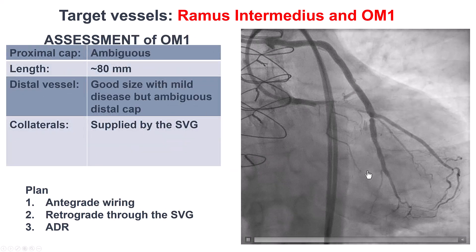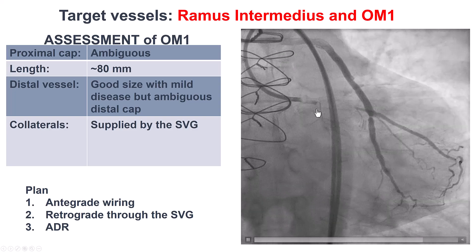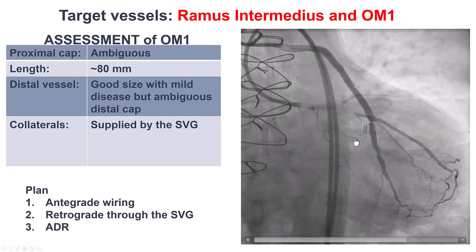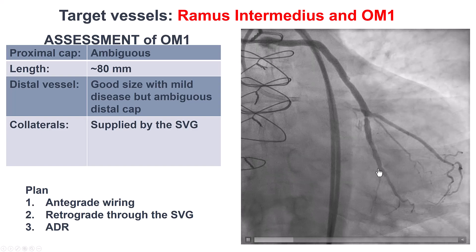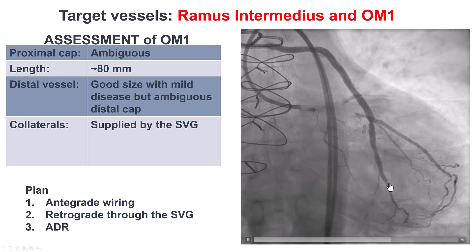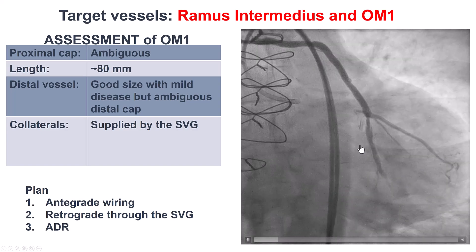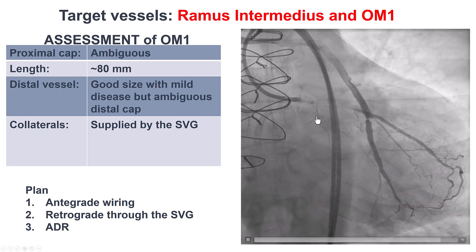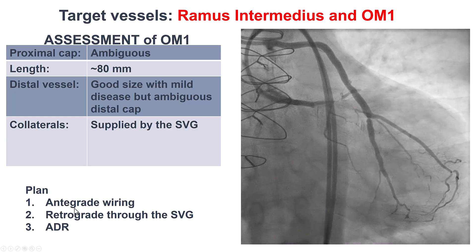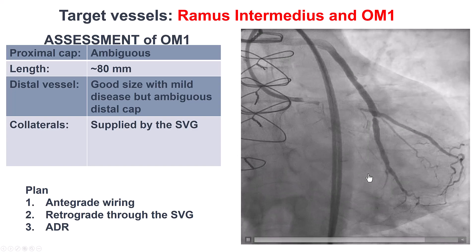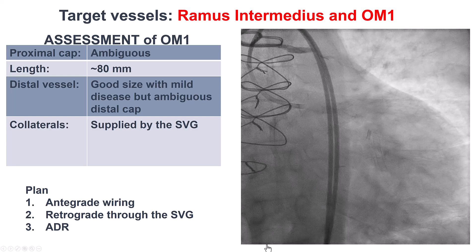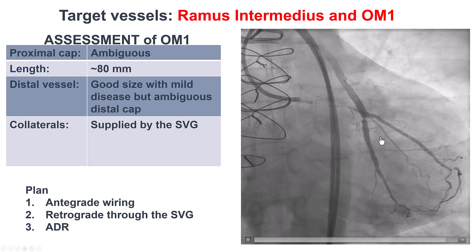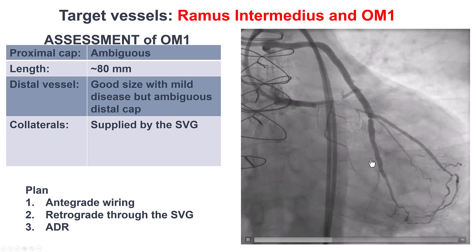Regarding the OM CTO, which was more challenging — this was a much longer CTO, once again with an ambiguous proximal cap, but there are some stents in the proximal circumflex and the OM1. The distal vessel is good quality, filling through the SVG. However, there may be some retrograde filling, and that portion of the vessel seems diffusely diseased. Our plan was to start with antegrade wiring attempts, and if that didn't work, try retrograde — but the angulation was extreme, making it very hard to advance a guidewire and microcatheter retrograde into the obtuse marginal branch.